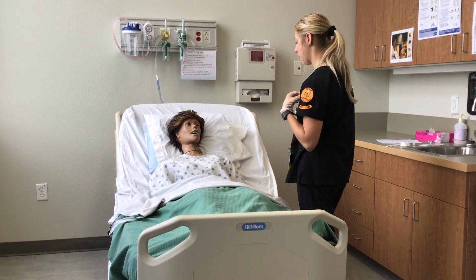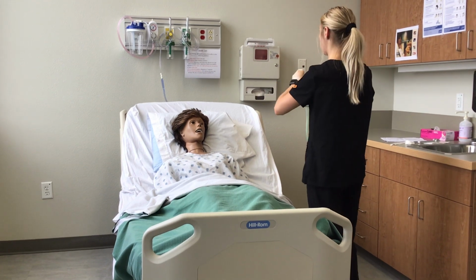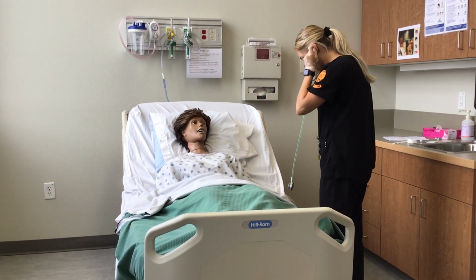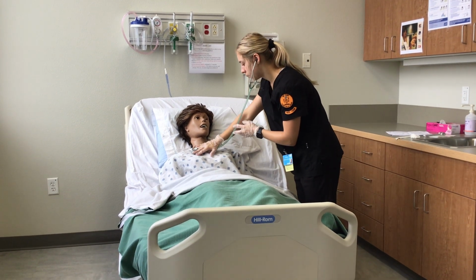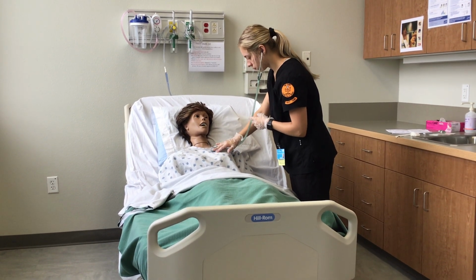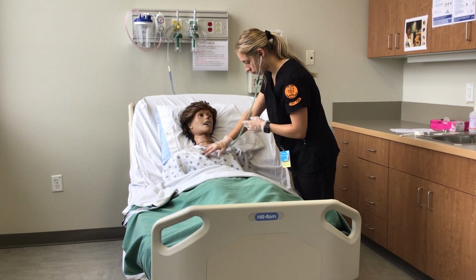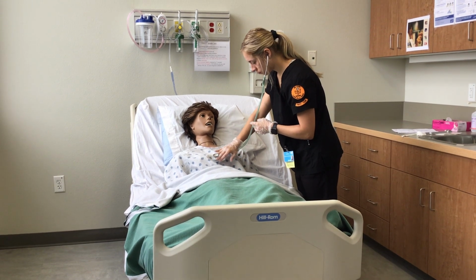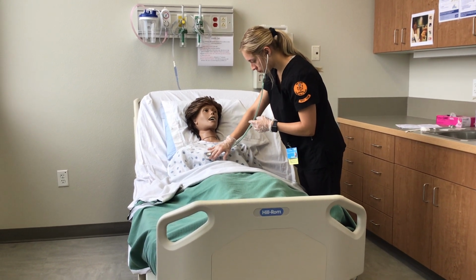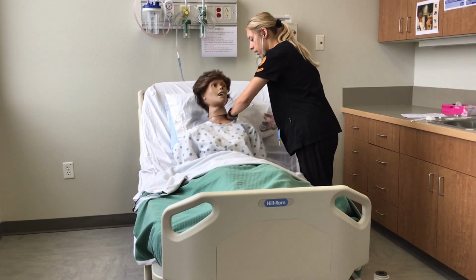So now I'm going to listen to your lung sounds and just go ahead and take a deep breath every time you feel my stethoscope. Good. We're going to do the same thing on the back side.